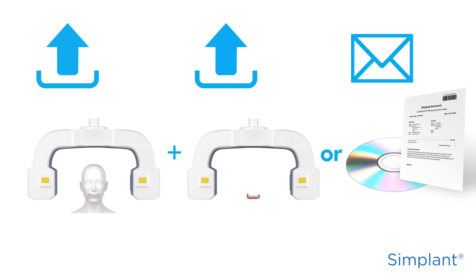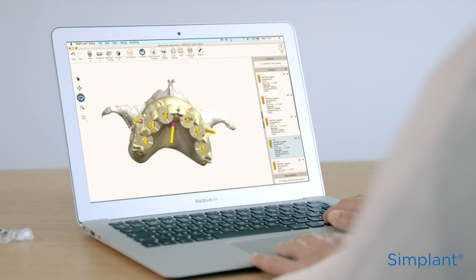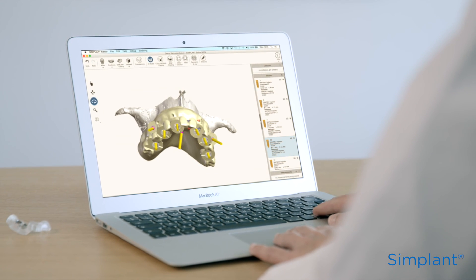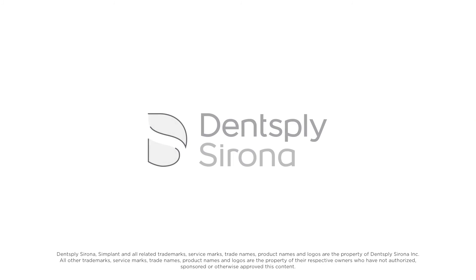Alternatively, you can send the scan files by postal service to Simplant. If you choose this option, check the box in MySimplant.com. That's it — you've learnt how to prepare a bite index and scan prosthesis with dual scan markers, as well as how they're both used in the dual scan procedure. But don't forget: throughout the process, the key to success is the accuracy of the information you collect.